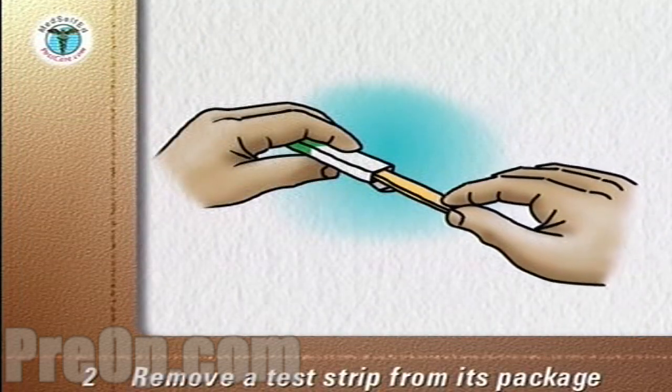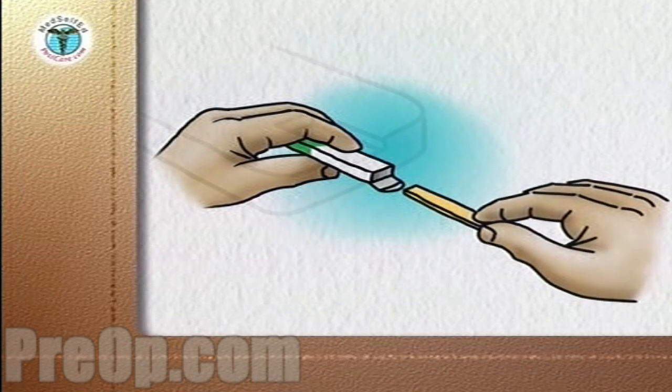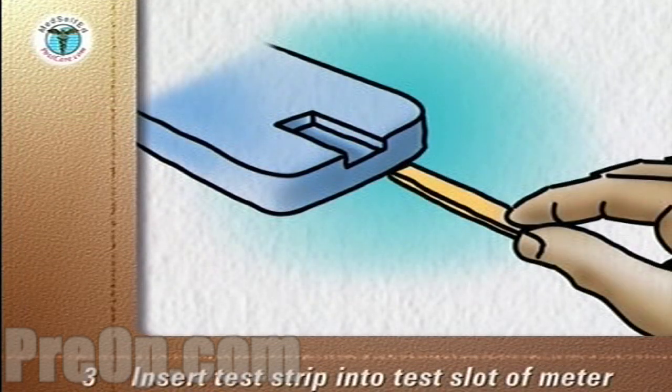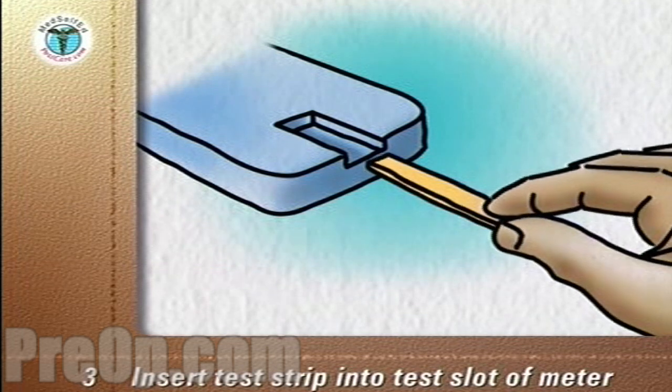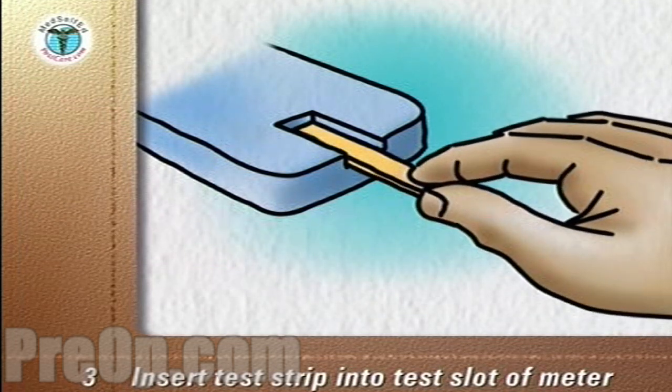Remove the test strip from its package. With the meter off, insert the correct end of the test strip into the test slot of the meter according to the manufacturer's instructions. This usually turns the meter on.